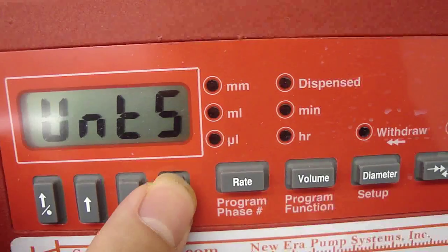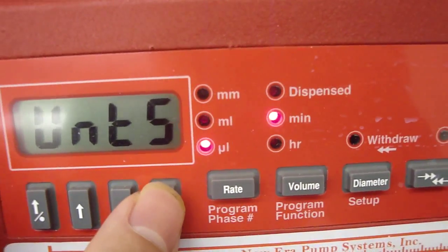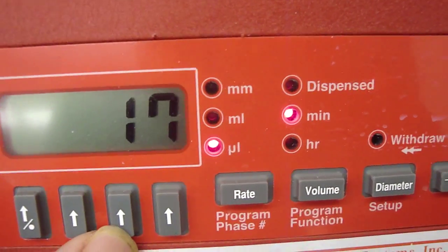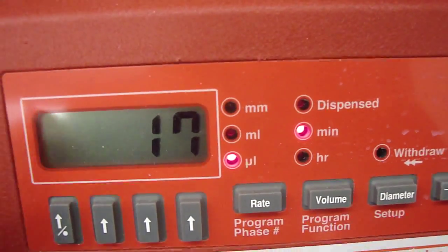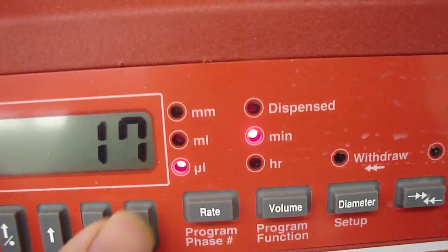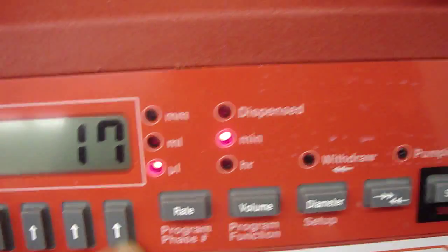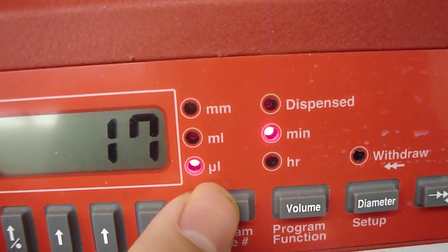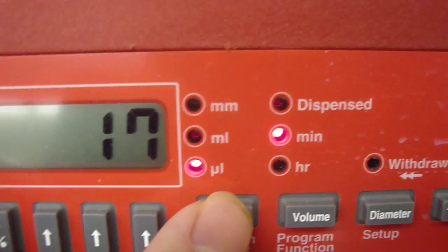Press the arrow here to change the unit from milliliter per minute to microliter per minute. So now we have to change it back to milliliter per minute.